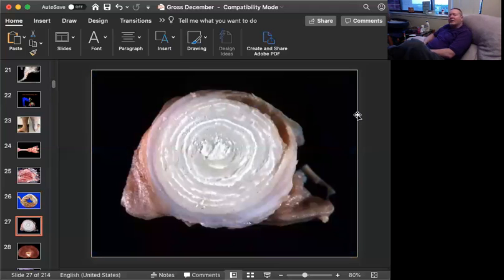This is tissue from a sheep. Can you give me a morphologic diagnosis and a cause? Okay, time's up. Well, it's tough to see exactly what you're looking at. There's a lot of normal tissue left. It's round, but if you've seen this lesion before, you'll recognize it as chronic active suppurative lymphadenitis.